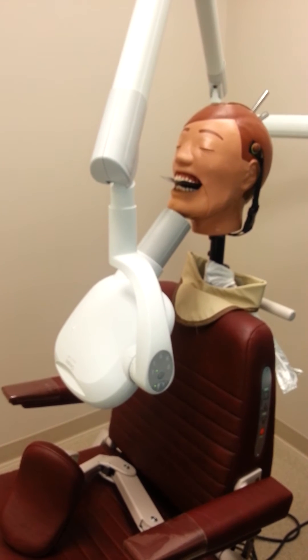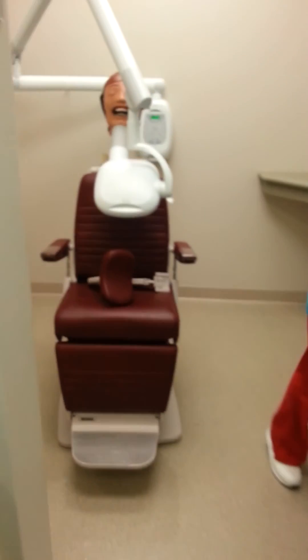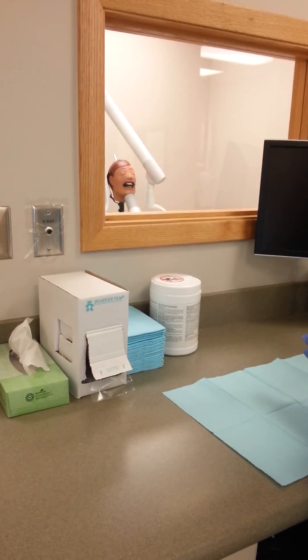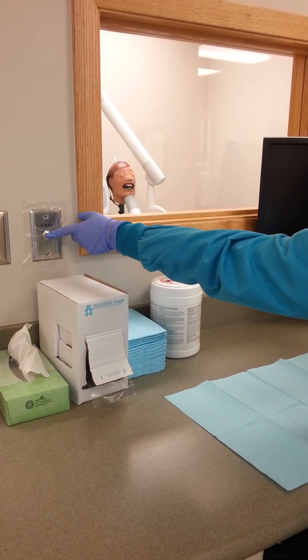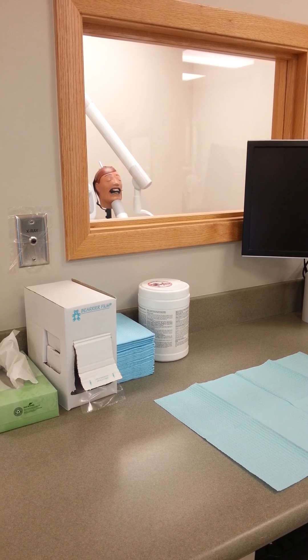Once everything is placed, we are ready for exposure. We leave the exposure room and hit the exposure switch for full exposure. Once we are done, we can relieve the patient of the size 4 phosphor plate and go ahead and tear down our cubicle.